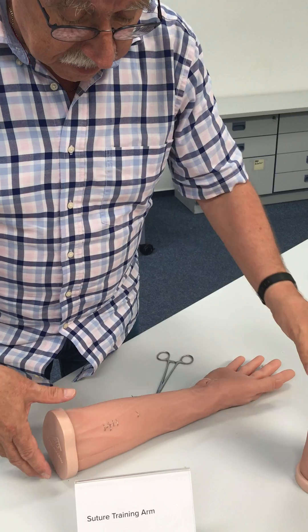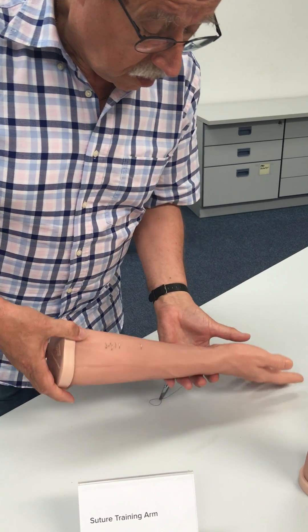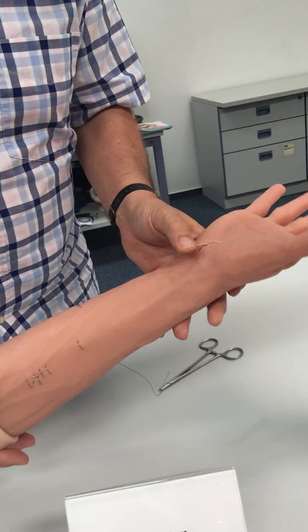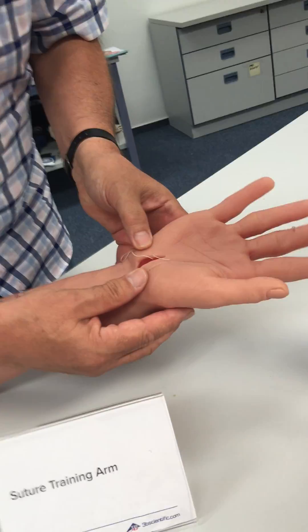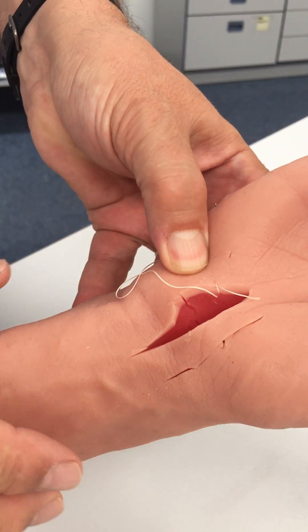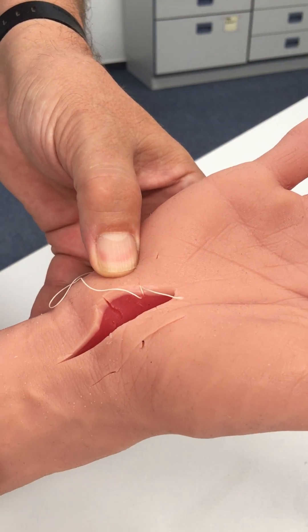Here you can see it already used with different cuts, and you can see there is not only the skin but also the muscle below the skin.